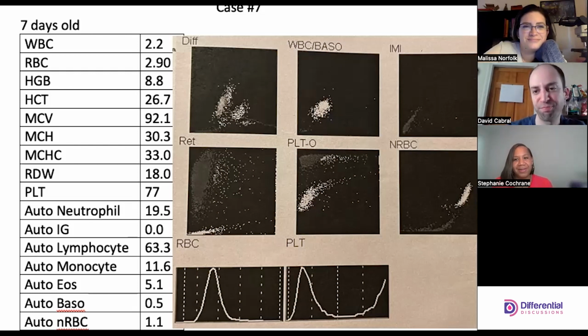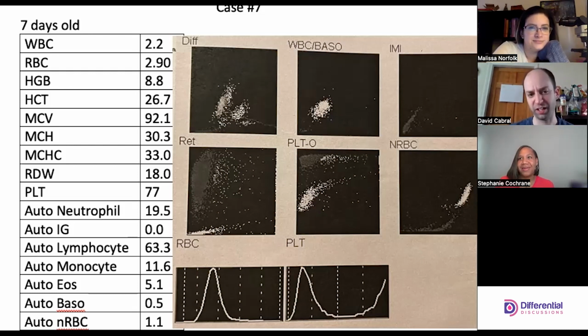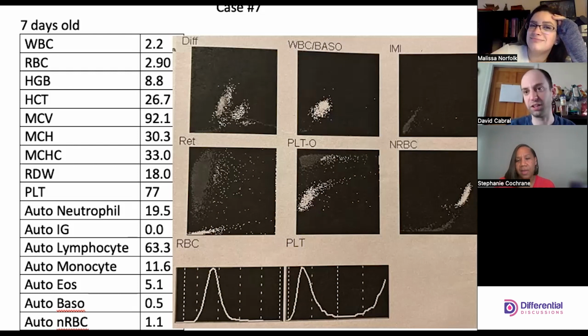Time for the slide, maybe? Yeah. So, 7-day old too. Oh, good point. I always miss the demographics. Okay, 7-day old. That's really worrying now, right? Now I'm thinking, well, okay, with a low white count, low platelet. Does it make your neutropenia worrying? Yeah, certainly. Very vulnerable demographic and then really low. I mean, 20%, it's like a 400 or a 500 absolute or less, right? That's really low. So now I'm worried. I'm wanting to see the diff.